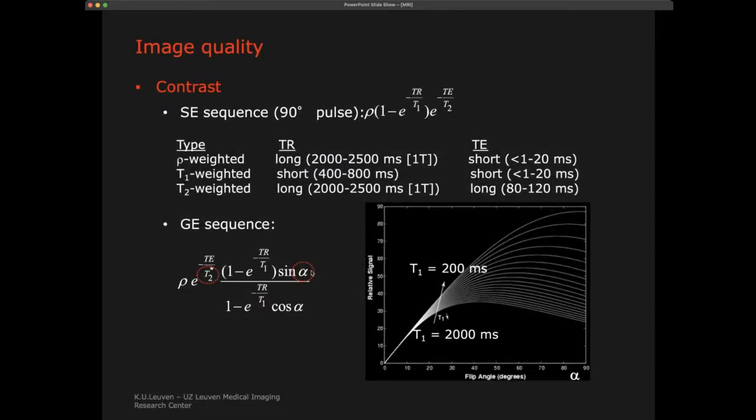Okay, now briefly a little bit about image quality and artifacts. One of the things I told you before is that the whole idea of MRI is trying to do measurements that highlight the contrast difference between T1 and T2. So we set the timing of our echo time, repetition time, and ways of doing the measurements, depending on trying to discriminate these as best as possible.